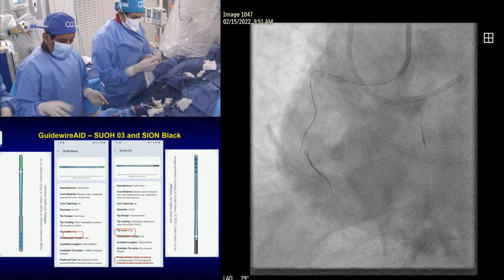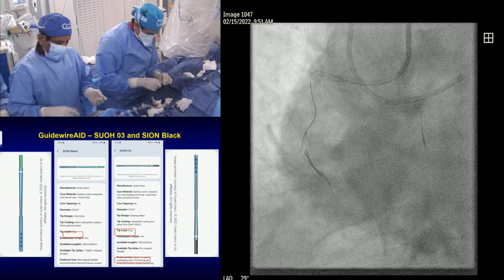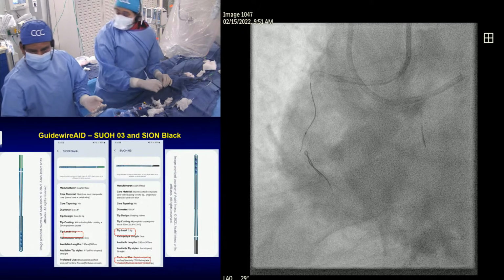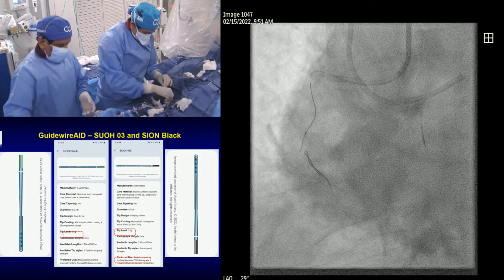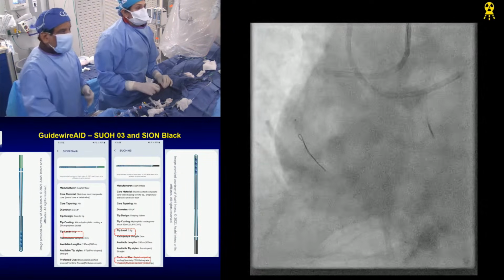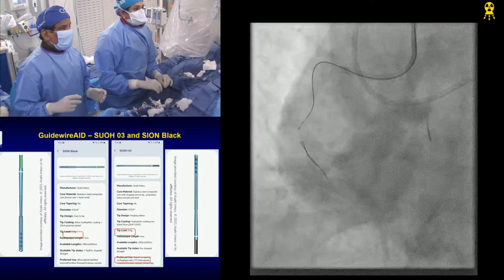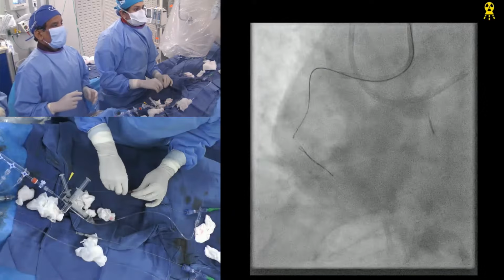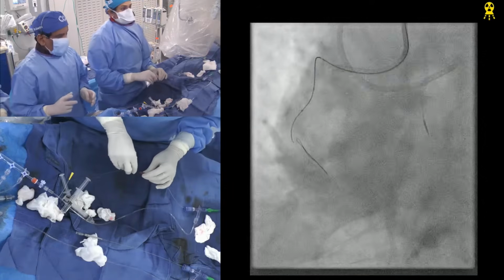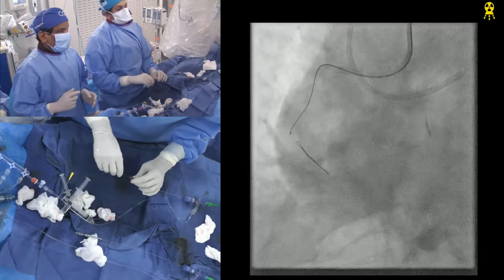Patient is still tolerating okay for the time being? That's the great thing. Yeah. Done. Thanks to Will. Fine. You want to say antegrade? What antegrade picture? Yeah. Okay.